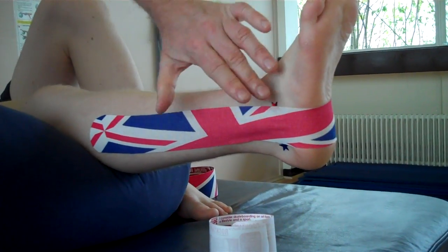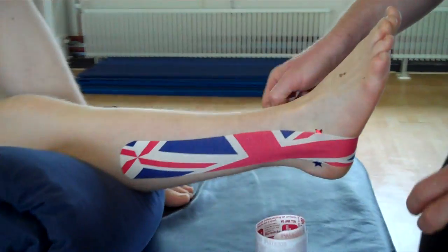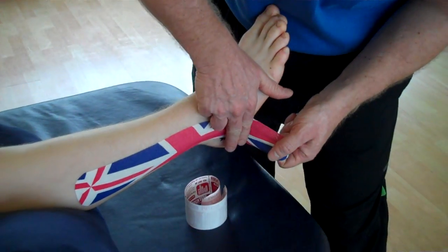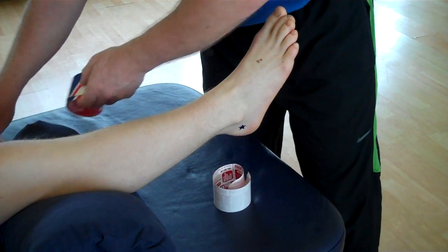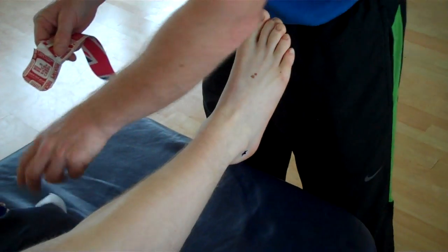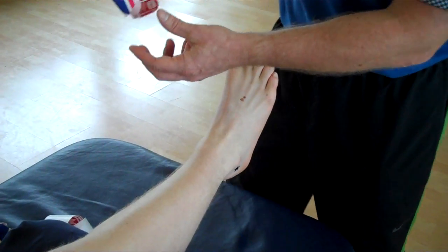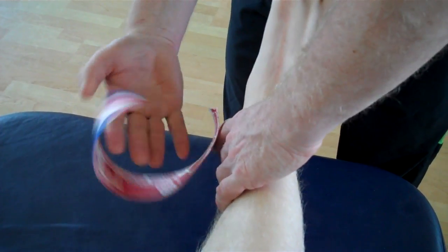At least then we are looking more at the proprioceptive effect. If I just put some pressure — it's not so bad. So you're going to do the same thing again, but apply less stretch. I'll peel the first part back and apply that just above the malleolus here. No stretch at the beginning and no stretch at the end.